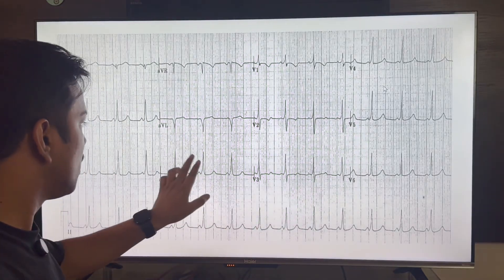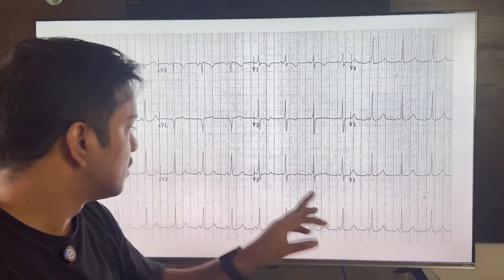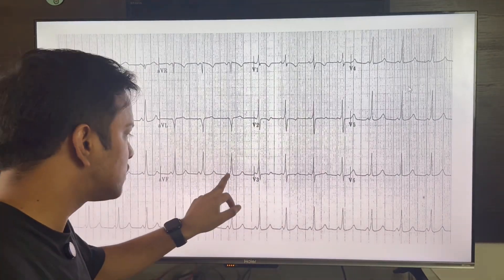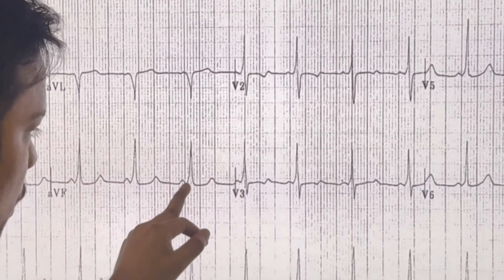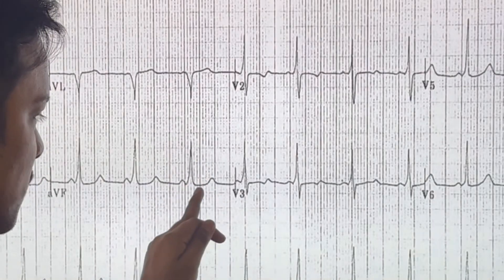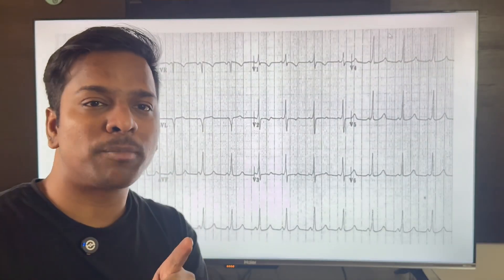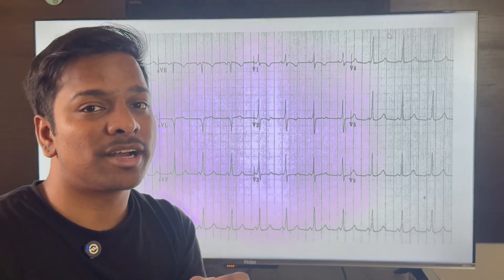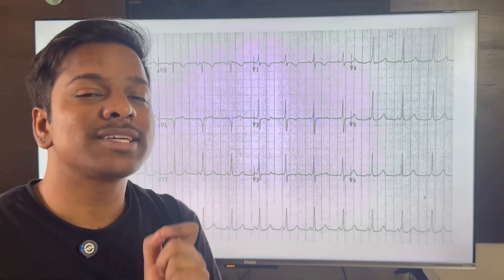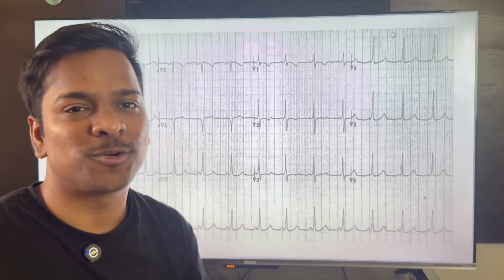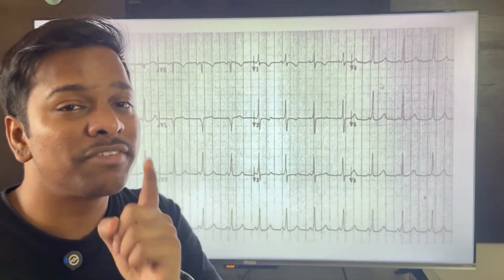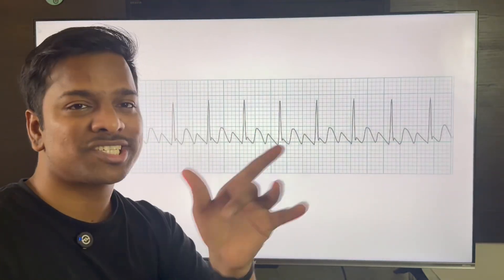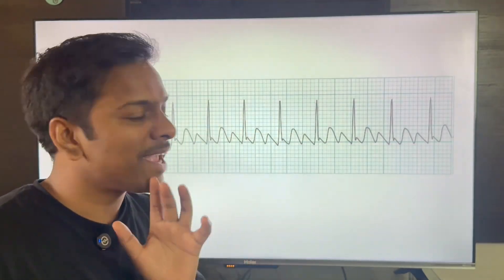In the next ECG, the heart rate is close to 100 — 300 divided by 3 boxes. We can see a slightly slurred QRS complex. This is another type of supraventricular tachycardia, particularly AV reentrant tachycardia, also called AVRT. A classic example is WPW syndrome, which occurs due to an accessory pathway. The definitive treatment is accessory pathway ablation.